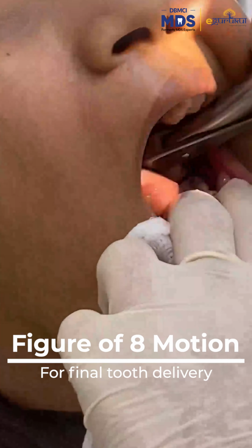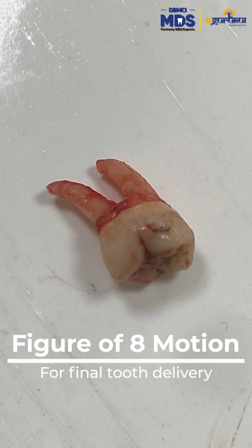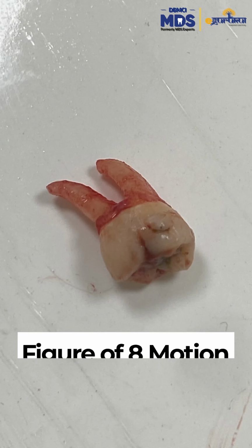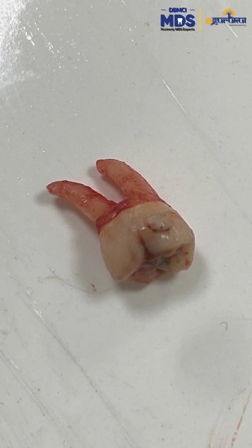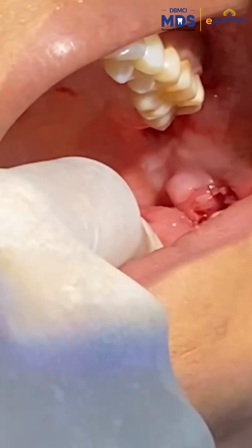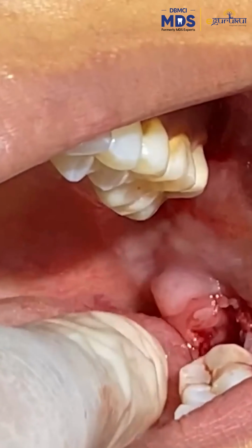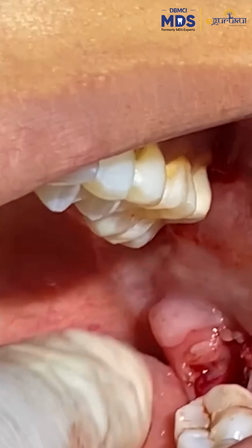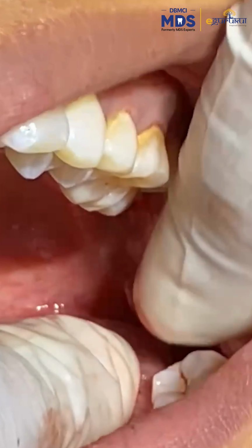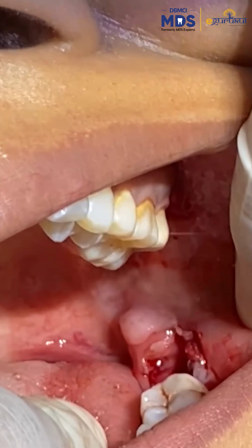When you stand with me, you will be able to see how easily the tooth is popping out very smoothly. In a figure of 8 motion, you inspect whether the tooth is out completely or not. You suction the socket, you irrigate the socket, and you examine the tooth as well as you examine the socket. The socket is absolutely nice, no soft tissue trauma around the tooth. Just simple flap reflection and the third molar is out.